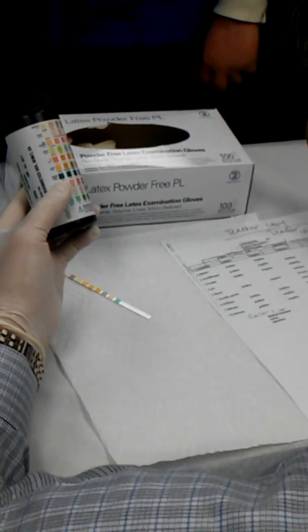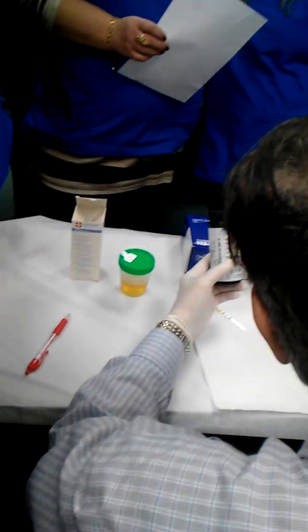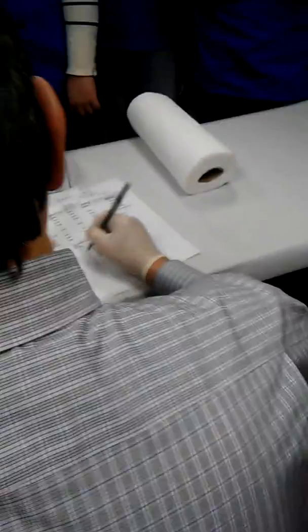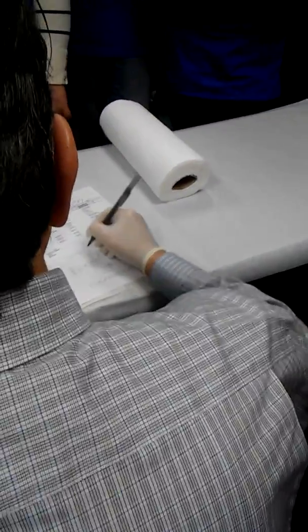For specific gravity, you have to put numbers. For pH, you have to put numbers. For protein, you have to put numbers. For blood, it's just positive or negative. For specific gravity, you will see what the number is. The number for specific gravity, SG, will be from 1.003 to 1.030. This is normal specific gravity, right? If you have these numbers, it's good. Okay, specific gravity is good.